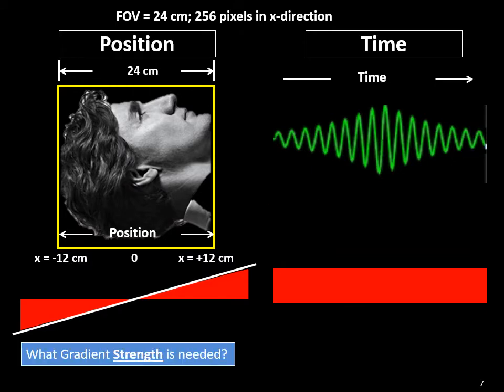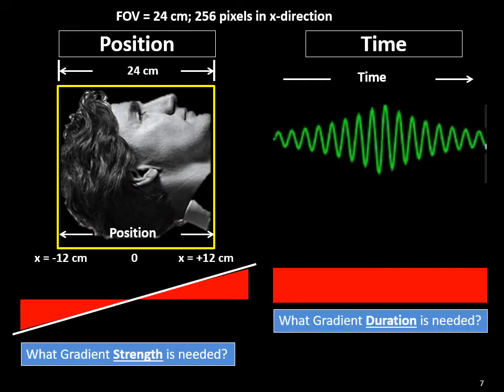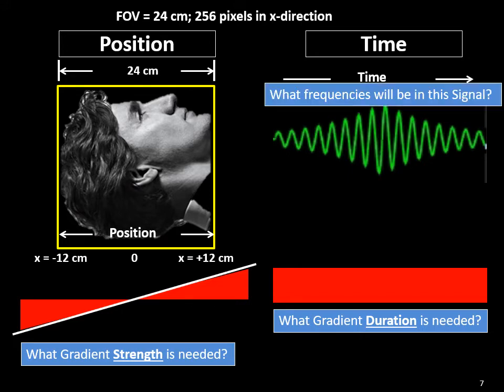So these are the questions. What gradient strength is needed? What gradient duration is needed? What frequencies will be in this signal?